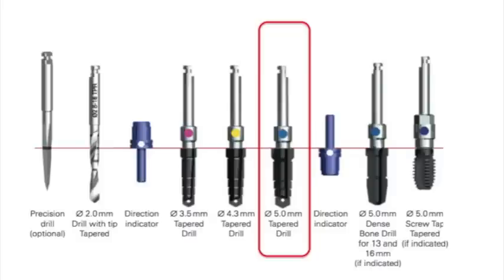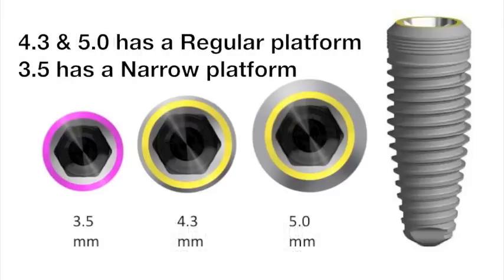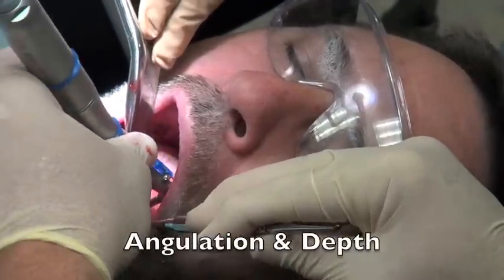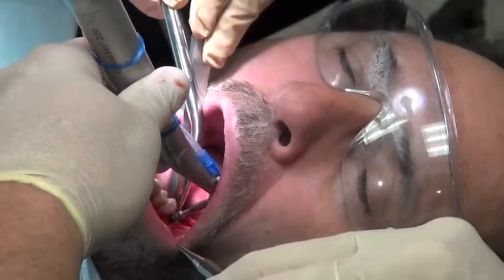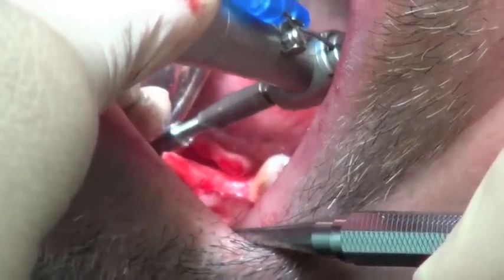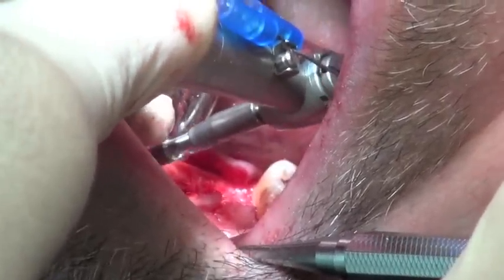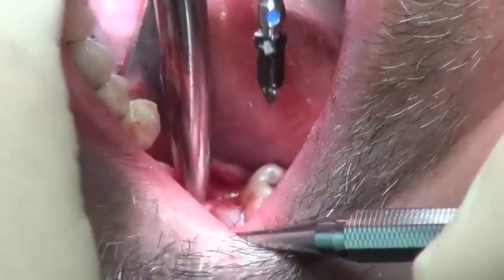You can take the collected bone, put it in a bone dish, add some saline, keep it cool, and you'll be able to use it later. This will be your last tapered drill, and then you'll assess whether you need any dense bone drills or bone taps. We're going to have a regular platform on top of this implant — it's not a wide platform implant, it has a CC connection regular platform. I'm thinking angulation and depth, putting the back of the drill head against the upper functional cusp, which is the lingual cusp, and I prepare again with the 5mm by 10mm long tapered drill down to the top of the ridge.